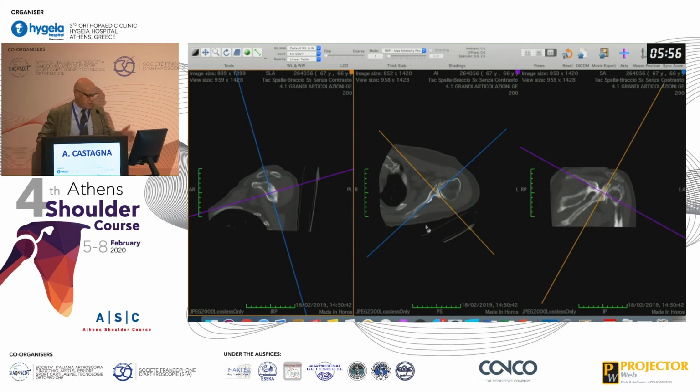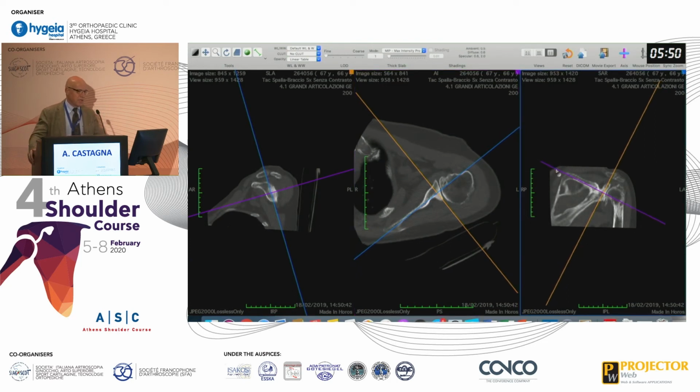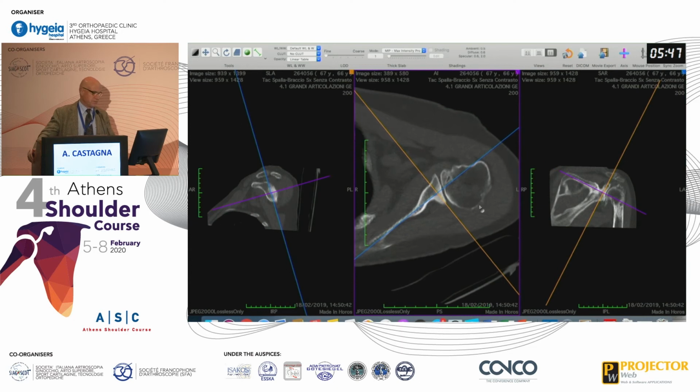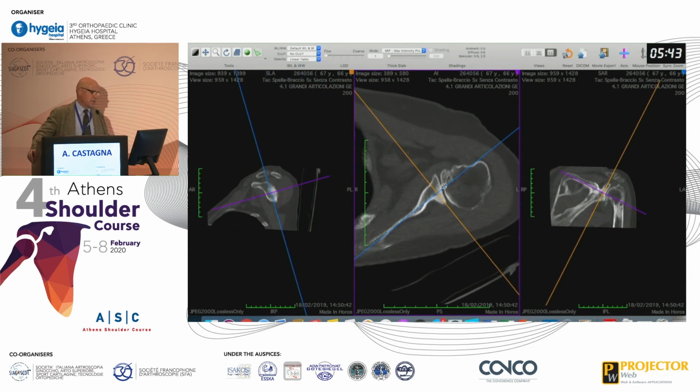So I skip the video, maybe it is boring, but I want to know the beta angle, the retroversion, and everything done in 2D plan. Because it takes, let's say, a few minutes. You see, calculating the angles, all the same stuff that you were describing, Philippe, before. It is a charge for the resident, the next generation of the surgeons.